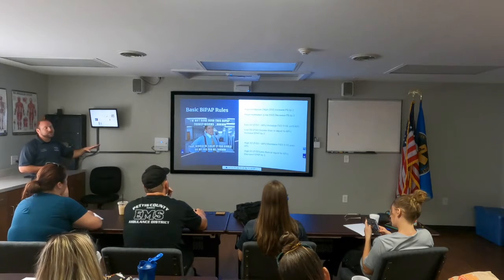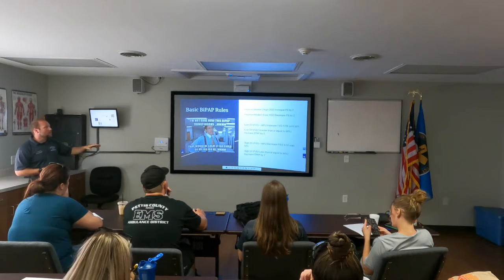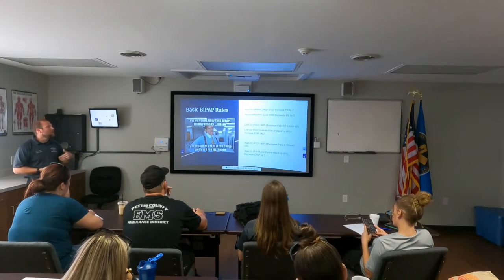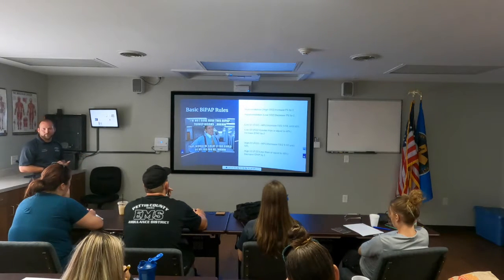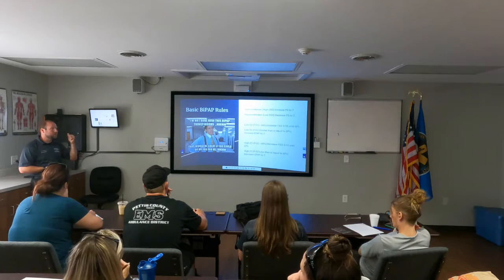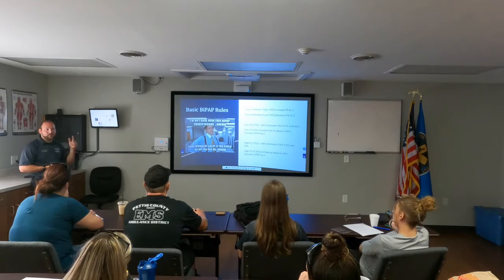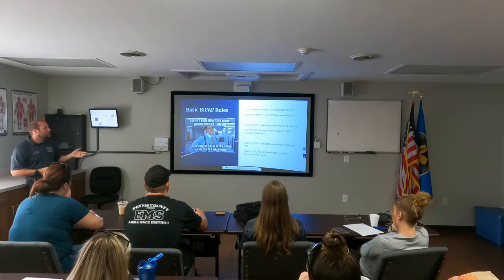Low O2, we are also looking at their PaO2 on their ABGs. If it's low and our FiO2 is below 60%, increase our FiO2 by either 5 or 10% until we hit 60. If it's low, but we are greater than or equal to 60, increase your EPAP. The big thing that affects SpO2 for your patient, as far as oxygenation, is always going to be your PEEP or EPAP and FiO2. For your end tidal, it's always going to be volume and respiratory rate. So we look at that.